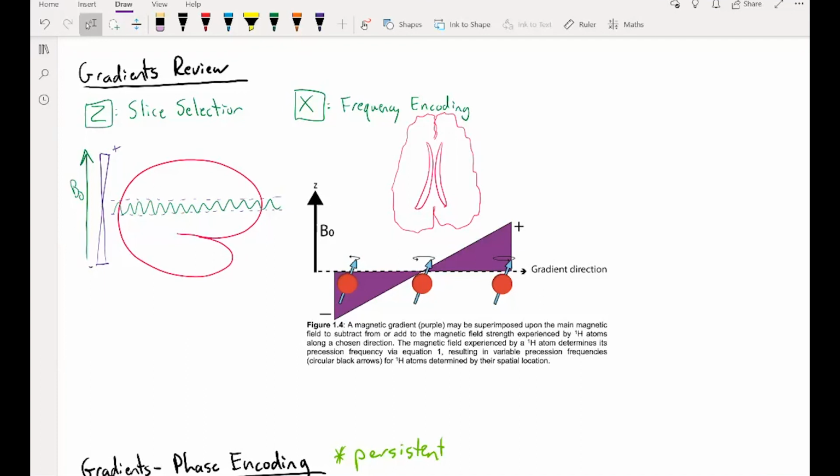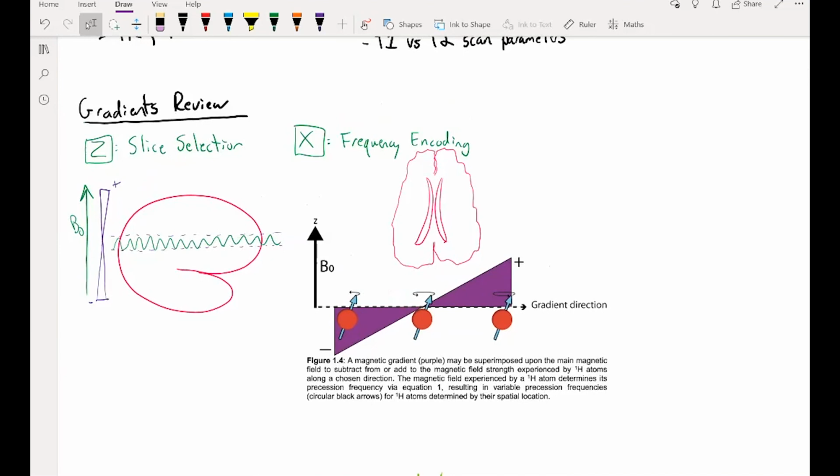the list. So we're definitely going to cover T1 weighted and T2 weighted sequences because they're simple and easy to start with. Then we're going to cover DTI, which is my specialty and very relevant for lots of people, and fMRI as well, which, similarly, is not my specialty, but very relevant for many people who are doing imaging research. If you have any other sequences that you want thrown in there, feel free to suggest. I'd be happy to cover them with you, as I've learned about many other sequences. My specialty in my PhD was different imaging sequences. But back to session 3.